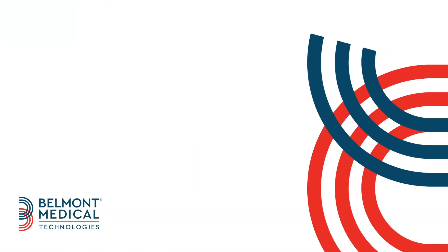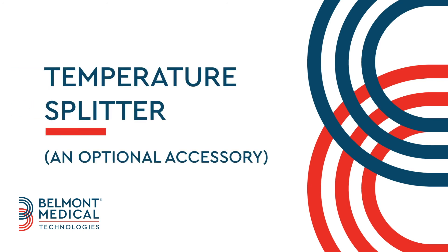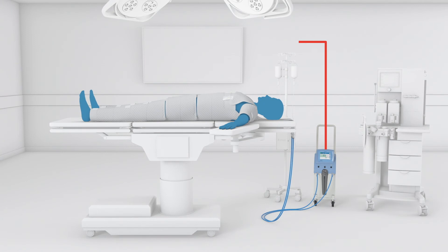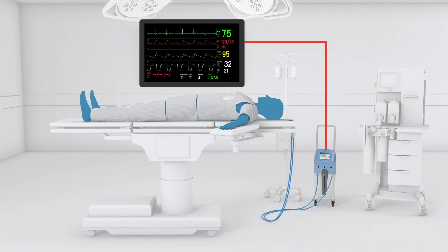This segment introduces you to an optional accessory called the temperature splitter, which can be used with both Alon and Critical and shows you how to set it up. The temperature splitter allows you to share the patient's core temperature from your Belmont temperature management system with an external monitor.